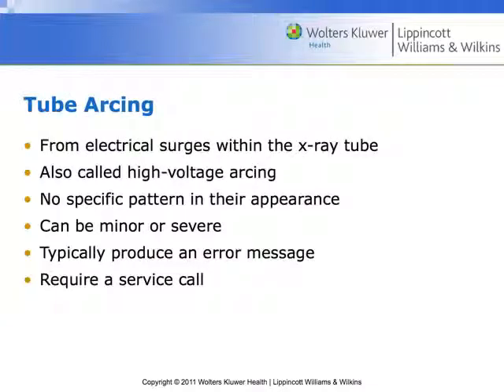Tube arcing. So anytime we have an electrical surge within the X-ray tube, we can have a high voltage arc, right? And there's not going to be a specific pattern to these appearances. They're going to be pretty minor unless there's a real severe problem, and typically that would have triggered an error message and require some kind of service call.